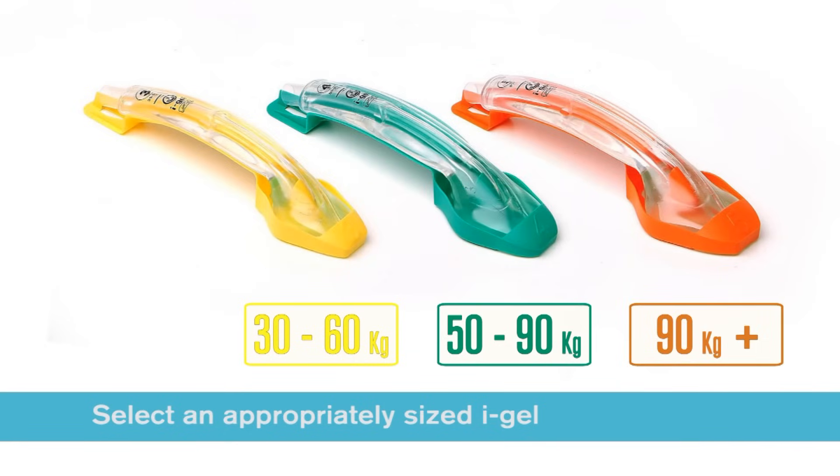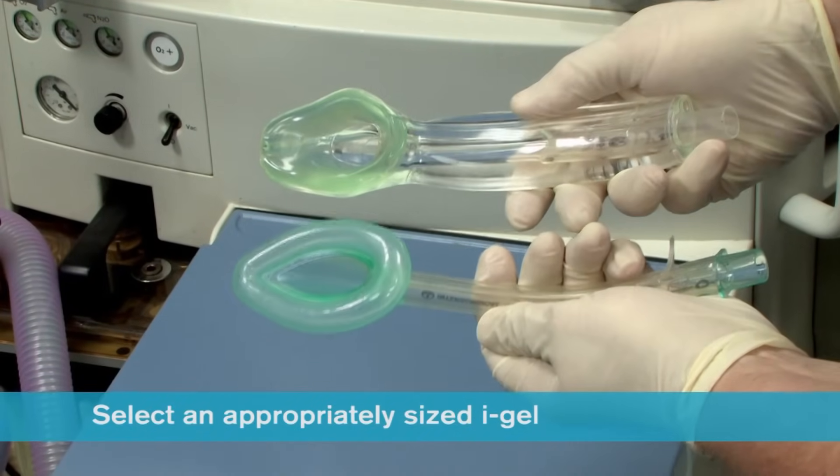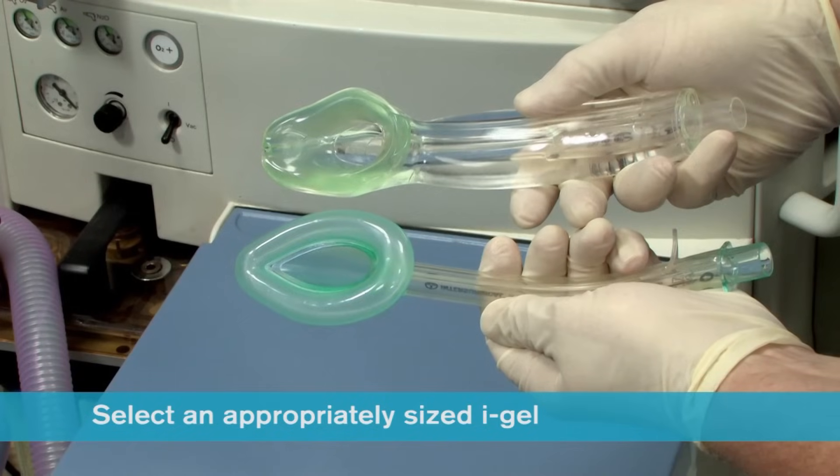When selecting size, it should be remembered that the iGel cuff does look smaller than the corresponding size of many traditional supraglottic airways with an inflatable cuff.